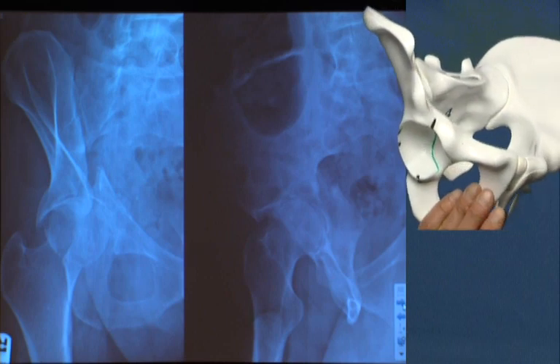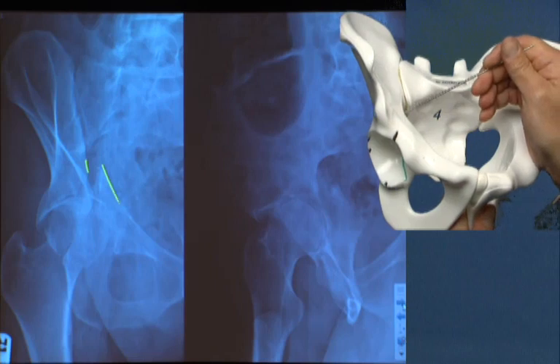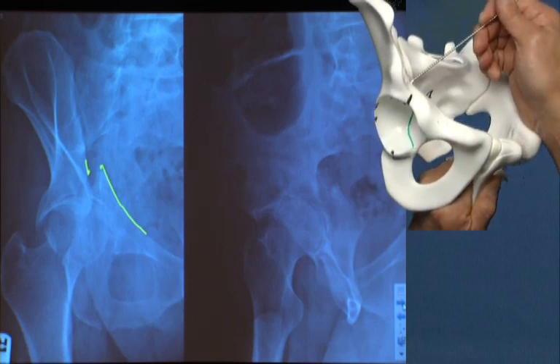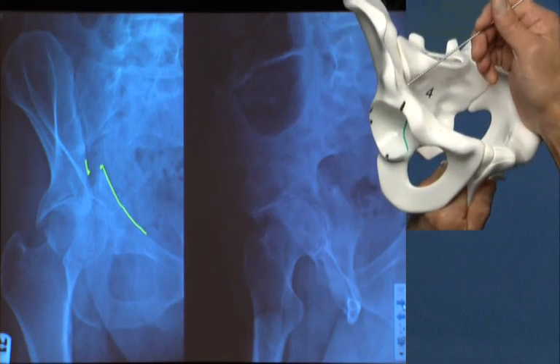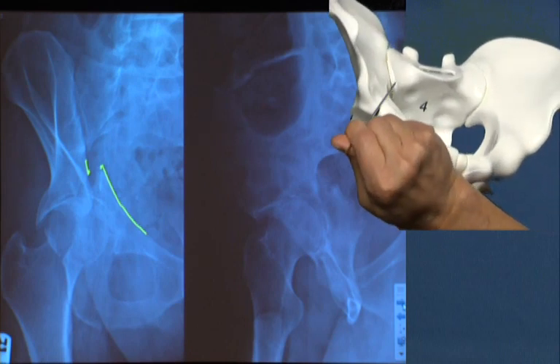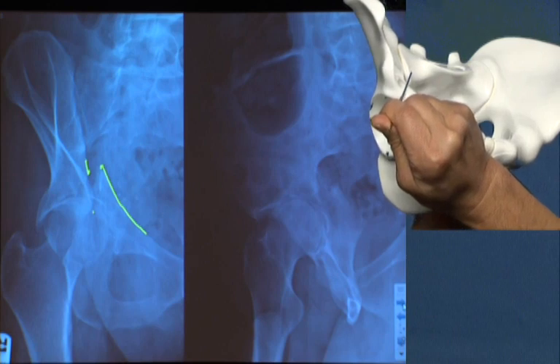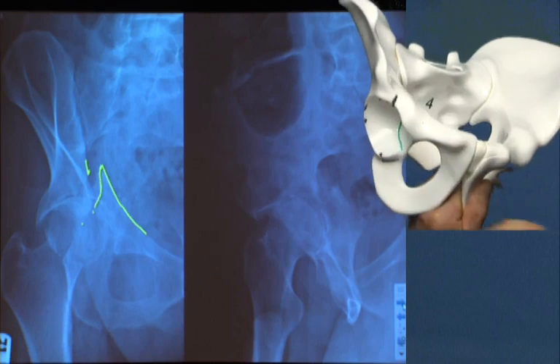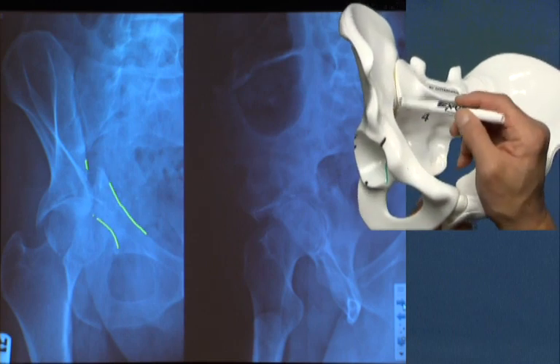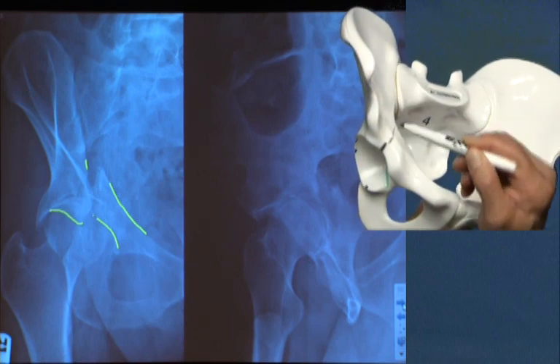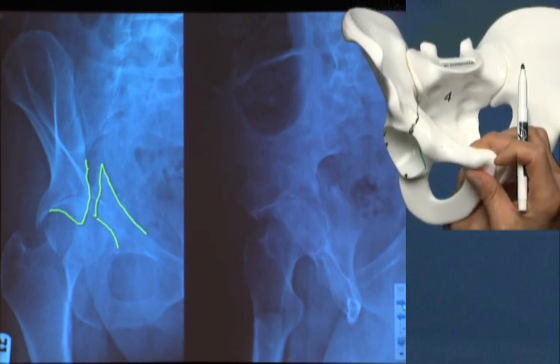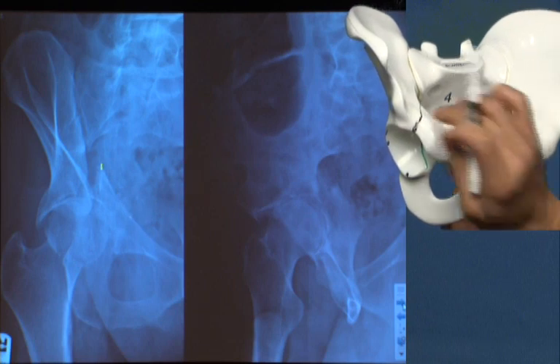On the obturator oblique, I can see an obvious wide disruption at the pelvic brim. I had previously drawn a mark based on my AP pelvis, and as I rotate into the obturator oblique, I can confirm I still see that disruption at about the same location on the pelvic brim. I previously wanted to connect this with the fracture line at the anterior rim. If I lay a line across that, is that plane accurately represented by what I see as the displacement? I think it is. You can see a portion of the anterior rim shadow on the obturator oblique, and based on that, I'm safe in extending this fracture line down to the anterior rim — I can see that the fracture line corresponds to that appearance exactly.